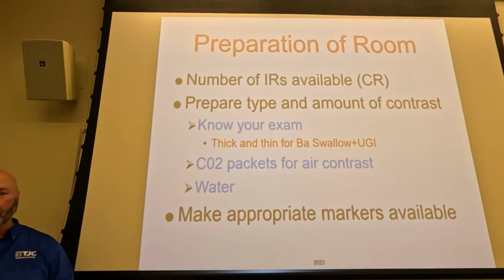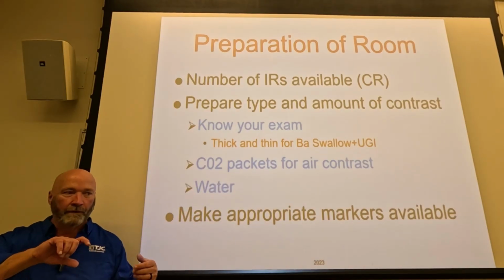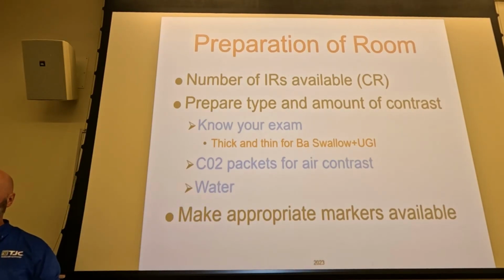and then have those packets off to the side. The doc may have a patient drink a little bit of barium, and they'll say, give me the fizzies or whatever. So at that point, you pour the CO2 into the water and hand it to the patient, who drinks it.